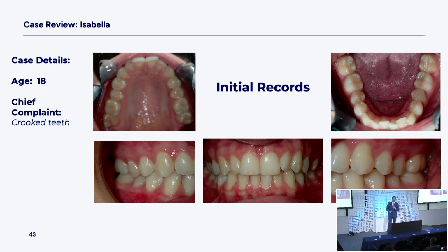The hint for you on the screen is that here's a telltale hint that you know you're supposed to have space at your lateral or your lateral is deficient. When you recognize there's a little more lower crowding than upper. If you see just a little more lower crowding than upper, that's a pretty good indication when you unravel these teeth. For my lower teeth to spread out and get straight, my top teeth have to travel a little further than the crowding is. So what you'd like to see is an equal amount of upper and lower crowding means everybody's going to move and there'll be no spaces.